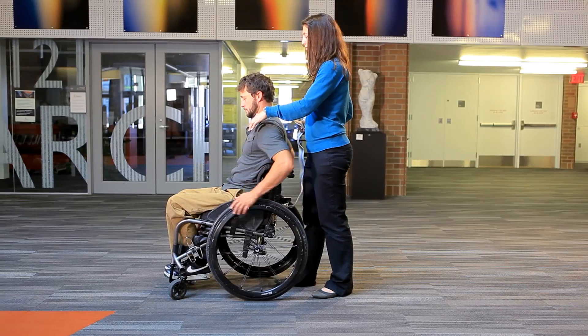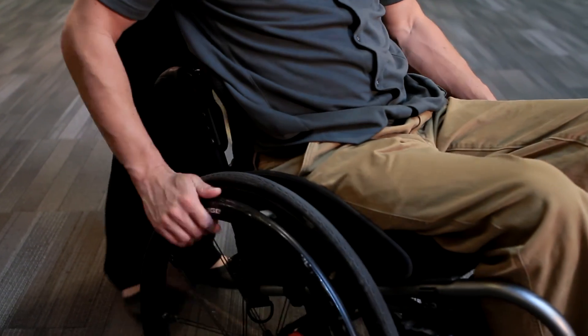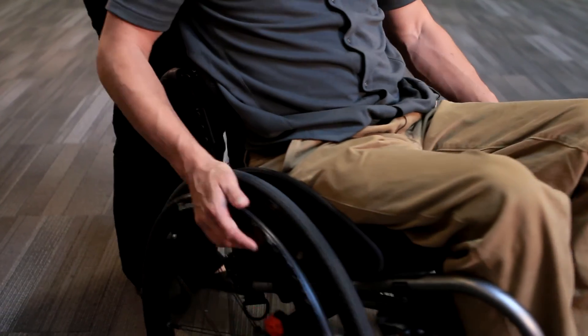Tilt into a wheelie with a spotter behind you. Next, practice a beginner method of pivoting: hold one rim in place while pushing the other rim forward. For example, pivot left by loosely grasping the left rim while pushing the right rim forward.